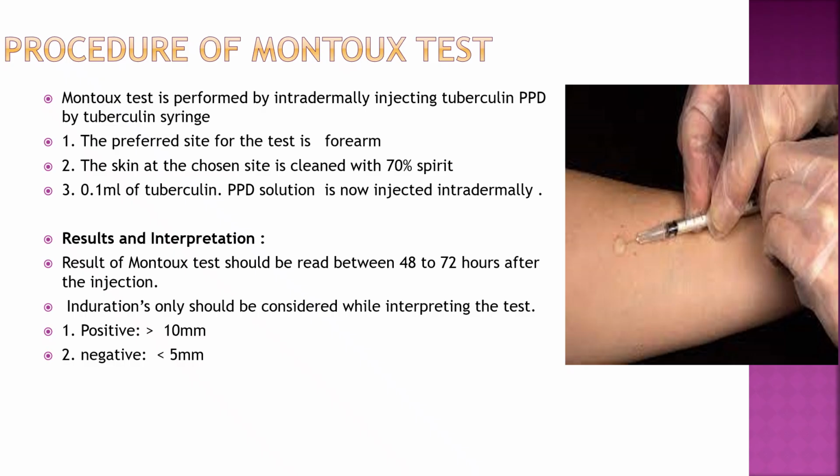In the result or interpretation, if the induration, that is swelling, is more than 10 millimeter, then it is positive. If it is less than 5 millimeter, it is negative, and in between 5 to 9 millimeter, it is doubtful, so you have to repeat the test.